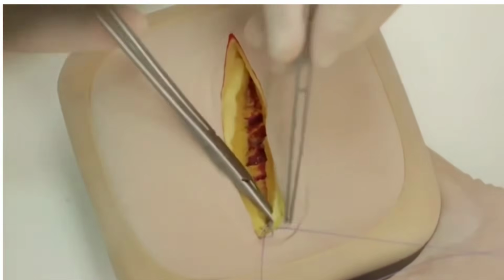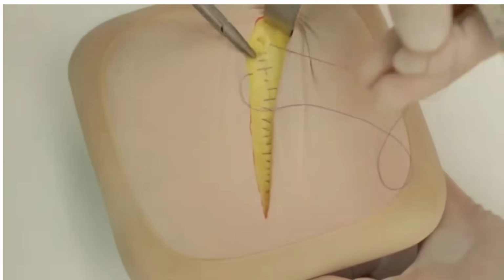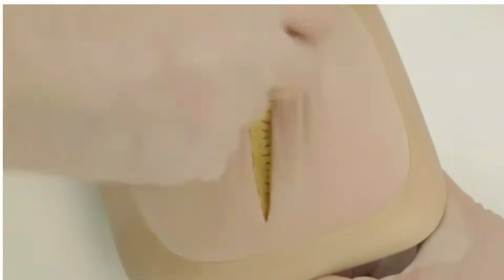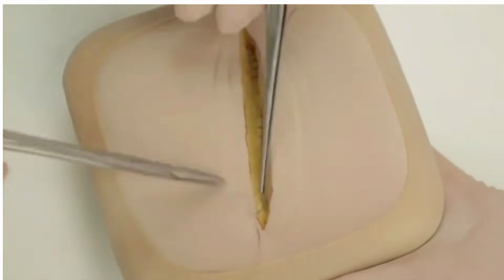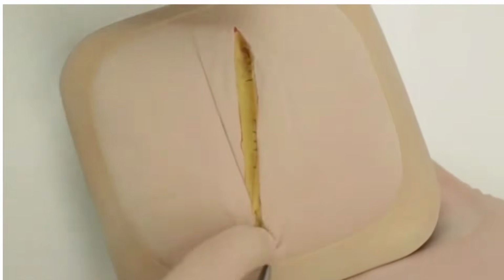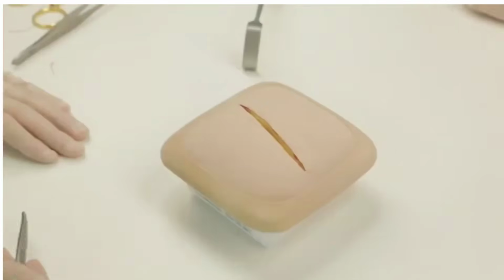Close the skin with sutures, staples, or subcuticular technique, depending on contamination level and surgeon preference. In contaminated cases, delayed skin closure or drain placement may be considered.